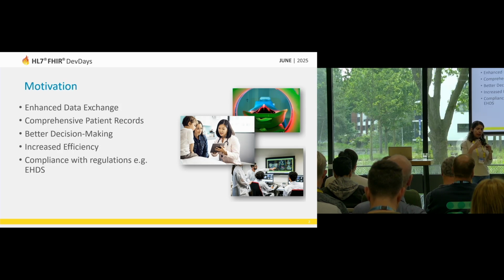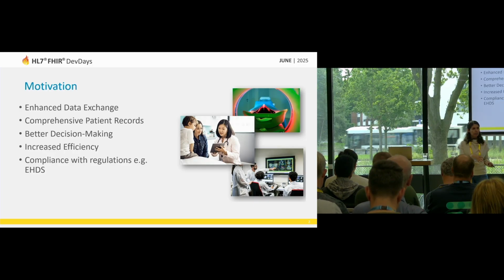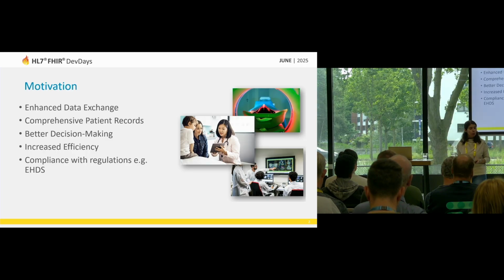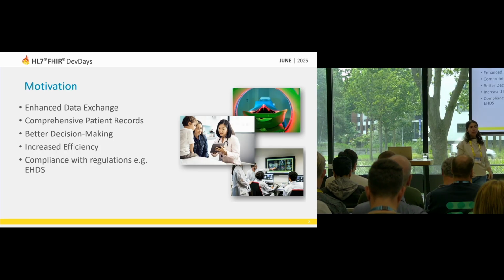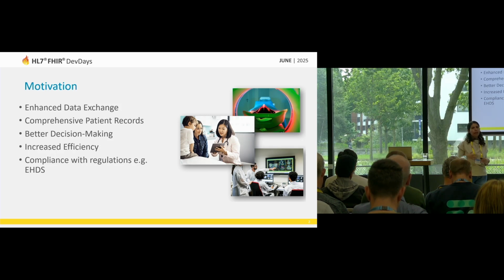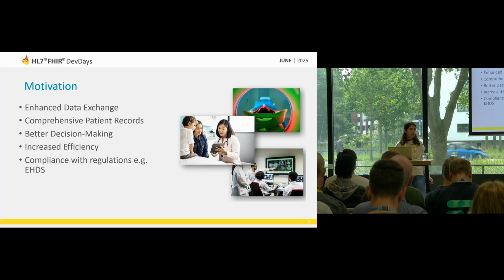Therefore, we want to break this bubble. We want to make sure that this information is not just staying in the radiology world, but is really reaching out to give more comprehensive patient records. We want better bases for decision support, and also to improve the workflows, so that the burden in the radiology department, or for the clinicians, gets reduced when we are able to use this data already in a FHIR format. And of course, there are some regulations, but we'll talk more about that later. Therefore, we also need to start thinking about FHIR in radiology.